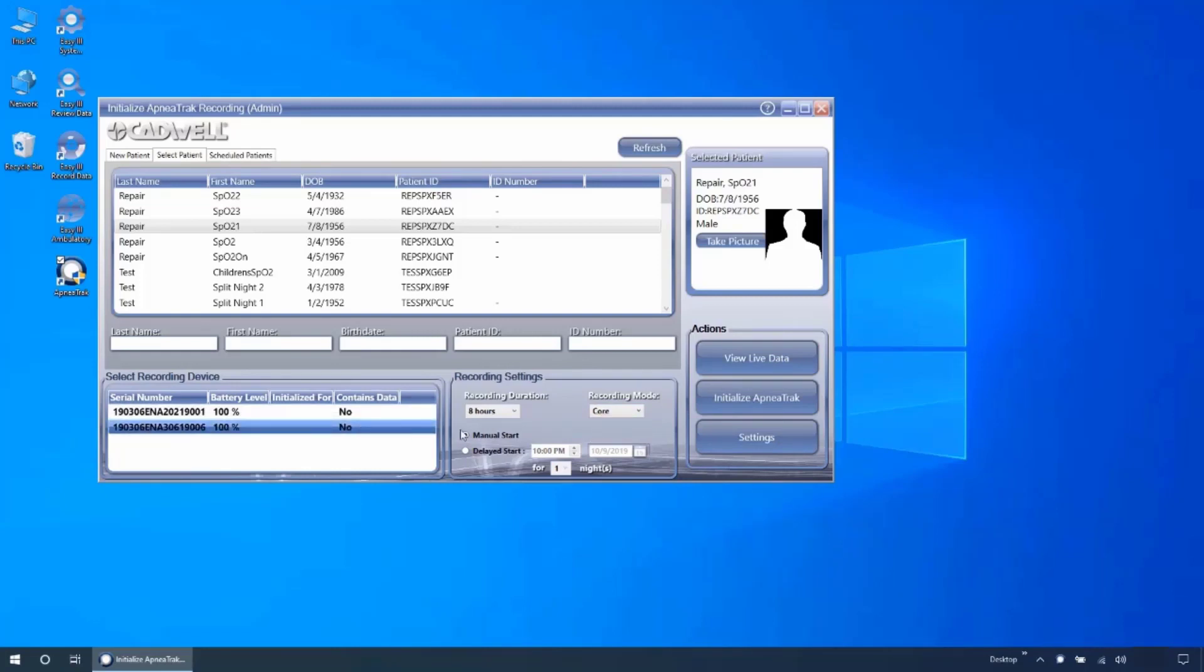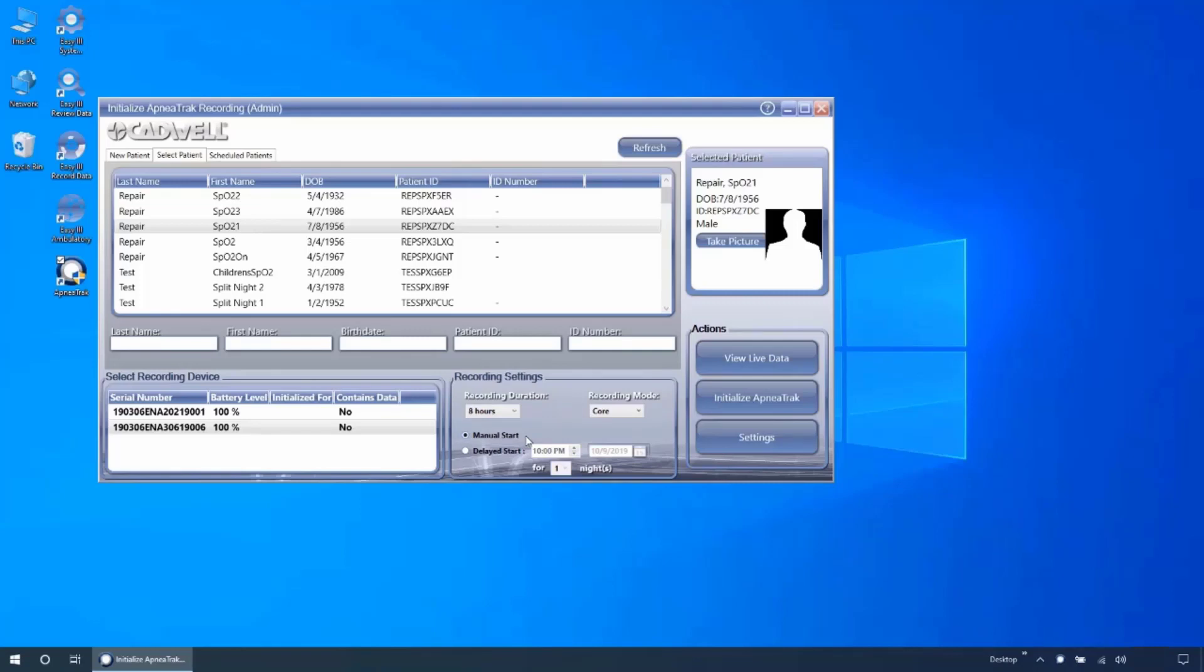If you are using a core device, this field is not selectable. The device can be configured for manual or delayed start. If manual start is selected, that will mean the patient will need to hold the button for three seconds or until they see the REC indicator illuminate in order to start the recording.